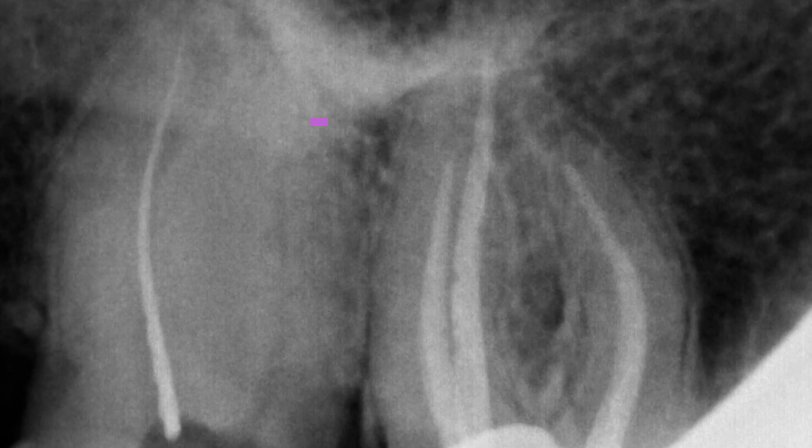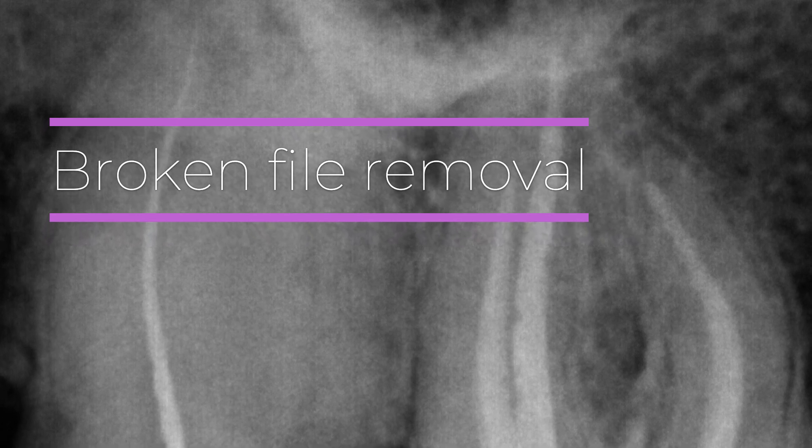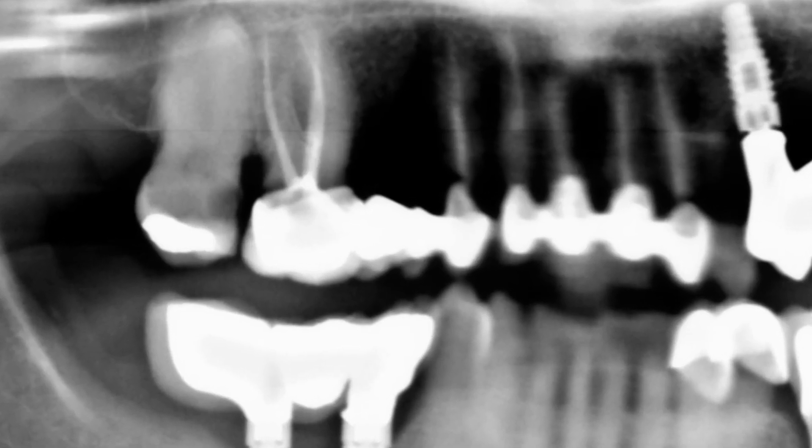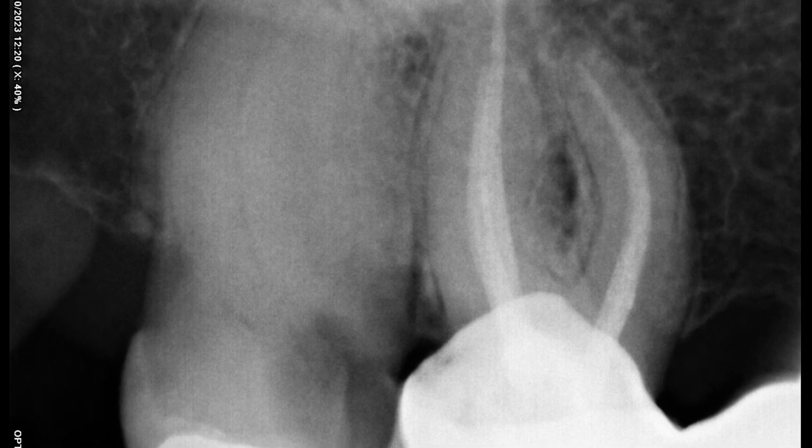Hello everyone. In today's case, I extract a broken file from the canal with the help of ultrasonic tips. This is a case like any other, with the a priori difficulty that the root canals are really calcified, and it will be difficult for us to reach working length.